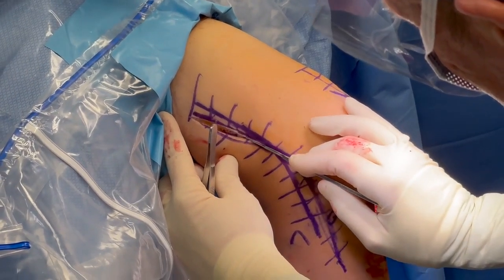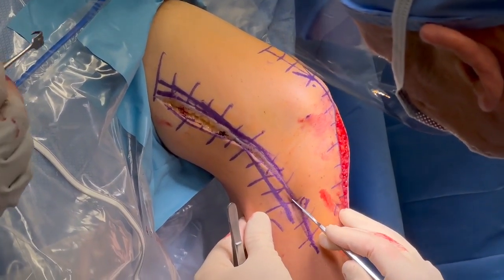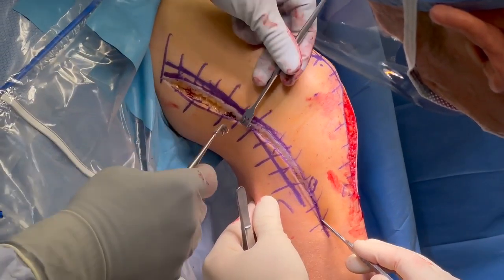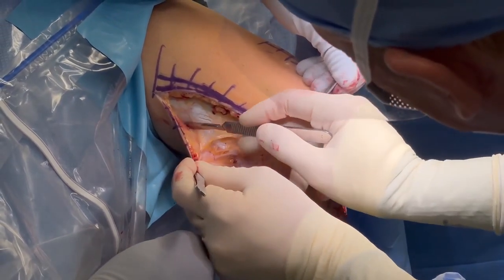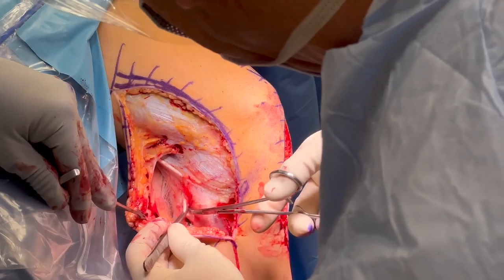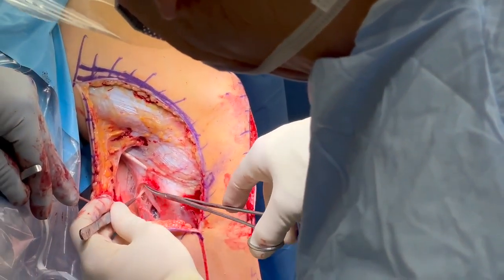A posterolateral corner standard hockey stick incision is made extending 10 centimeters proximally from Gerdy's tubercle for the FCL reconstruction. Dissection is carried down to the iliotibial band and the biceps femoris tendon. A common peroneal nerve neurolysis is performed to minimize risk of post-operative foot drop.